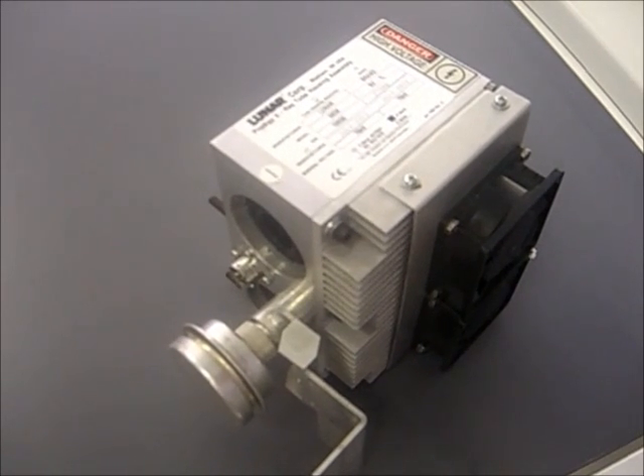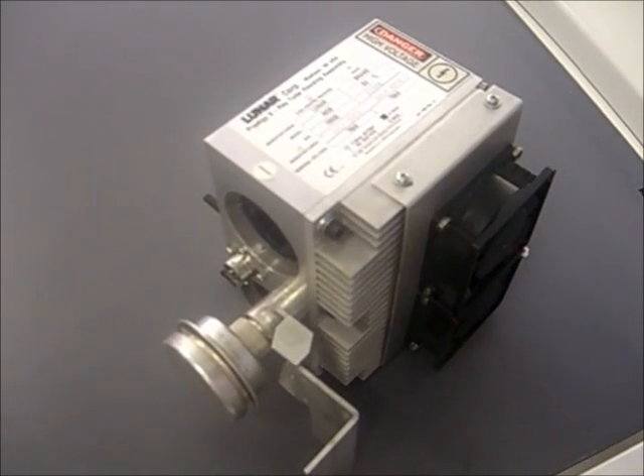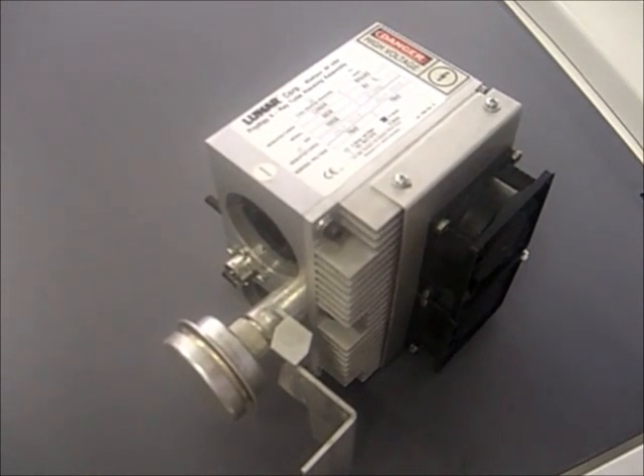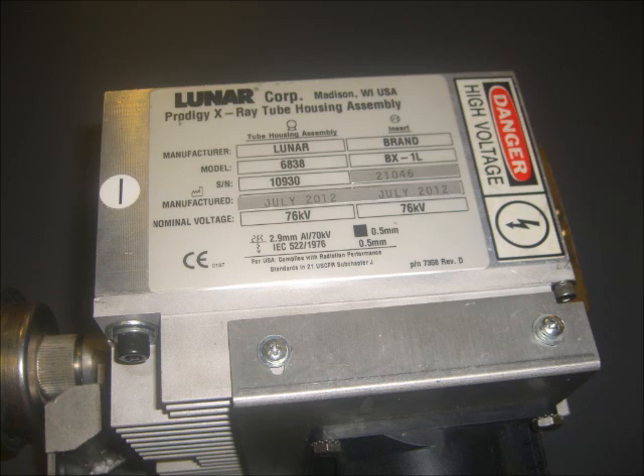The second tube I would like to talk about is the Lunar P1 tube, model number 6838. To find the model number of your tube, please reference the tube ID tag and look in the upper left-hand corner.